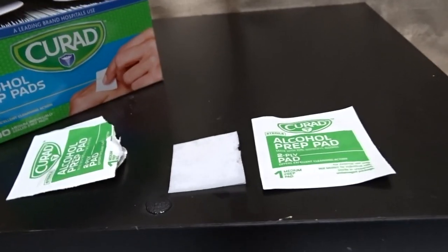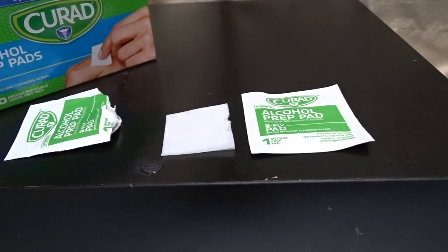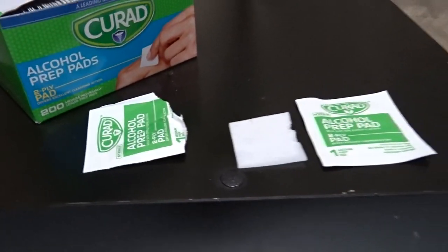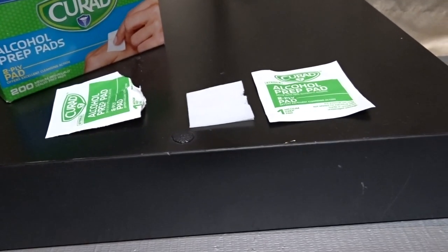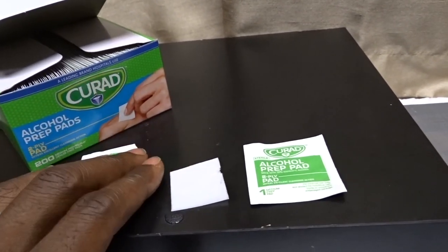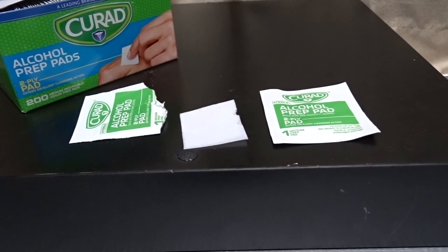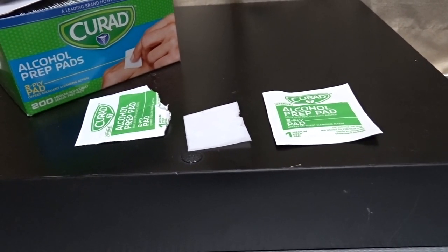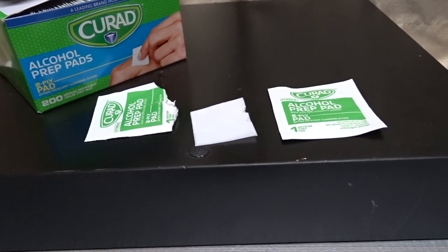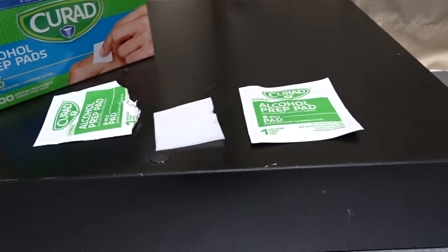You can also use these to clean wounds and to disinfect just about anything you want sterilized. They work very well for cleaning a thermometer before putting it in someone's mouth. Alcohol is great — it really sterilizes things and cleans wounds.